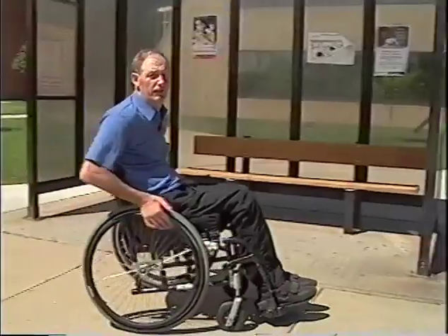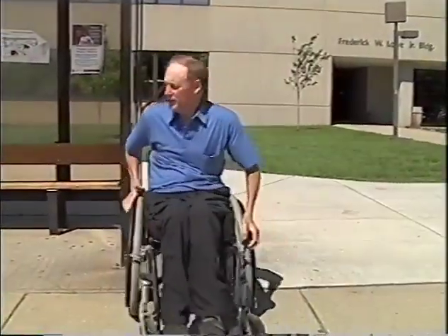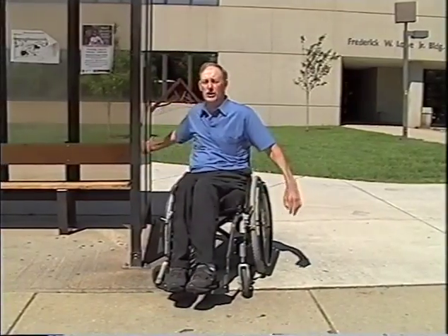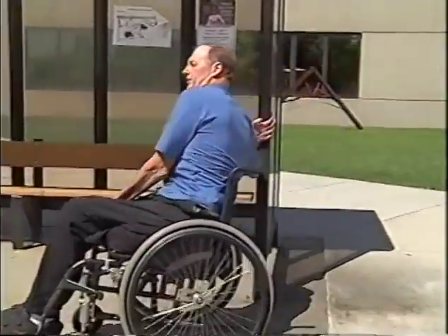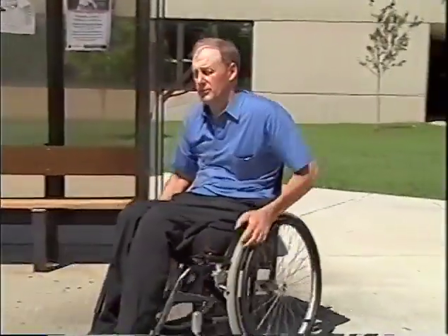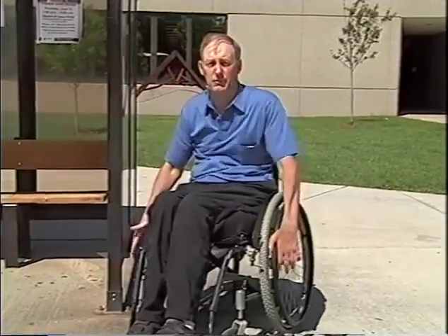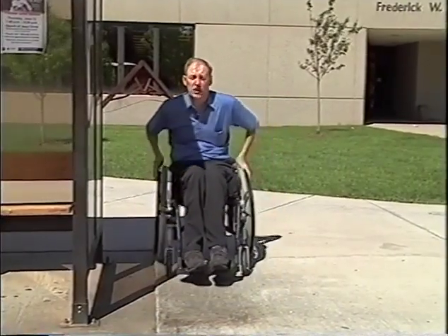Now when you're doing this, keep your thumb up. And the reason I call this Charlie's rule of thumb is because once you come around this corner, you can take and push off of the next obstacle or the next corner that you're on. So keep your thumb up, and that way you can judge how easy it will be, or if it's best for you to take a push off that corner.